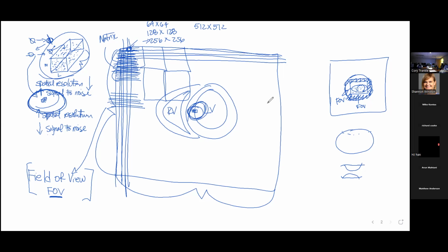How do we create the pictures? We've got to do the spatial resolution correctly. There's two descriptors of how we create the voxel sizes, the pixel sizes. Those are the field of view and the matrix. Okay. One more piece of that I didn't mention for voxels is the slice thickness. So remember, these things do have depth, and so we do adjust the slice thickness. Okay. Any questions?